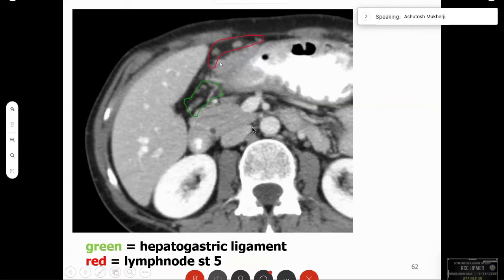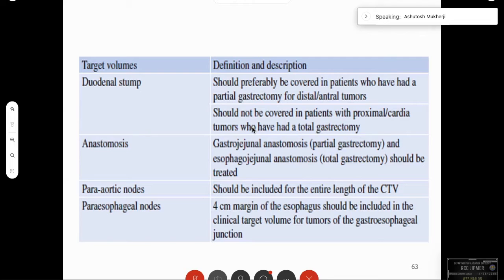The hepatogastric ligament runs between the liver and the stomach. Nodes in this area are sometimes missed because we put a CTV short of the area, thinking if we take a bigger CTV we might go beyond the anterior abdominal wall. The duodenal stump should be covered in patients who have had a partial gastrectomy for distal tumors. Anastomoses are important: the gastrojejunal anastomosis in partial gastrectomy and the esophagojejunal anastomosis in total gastrectomy should be covered as they are frequently sites of recurrence.